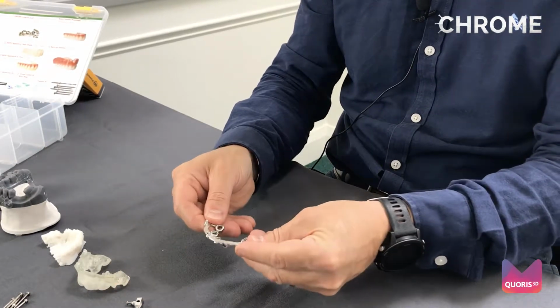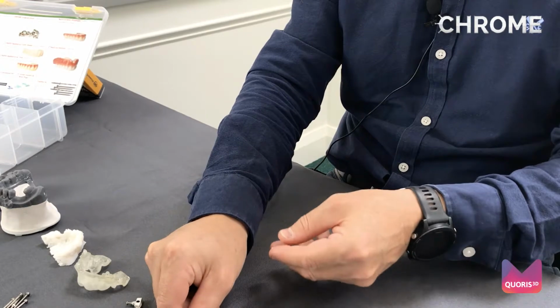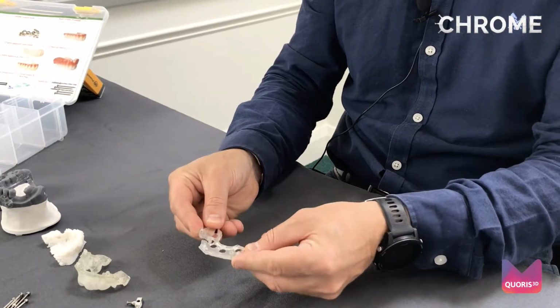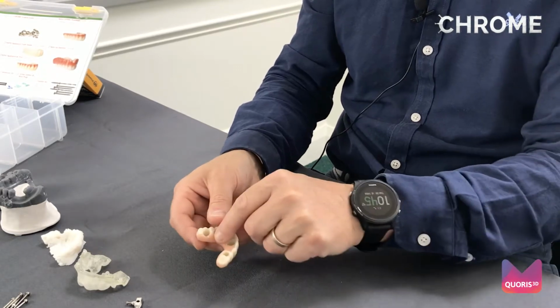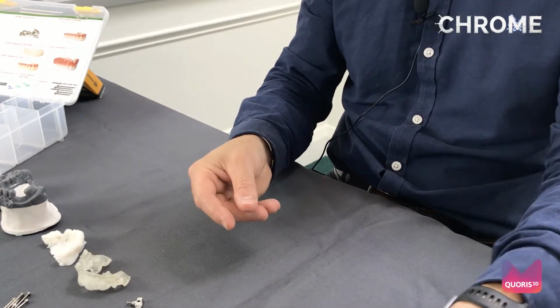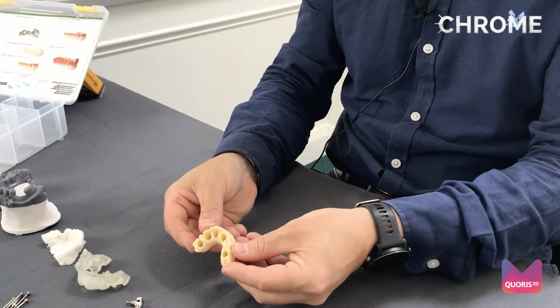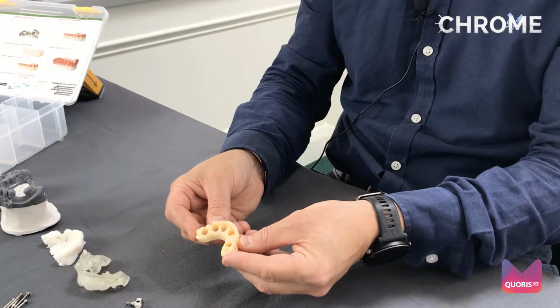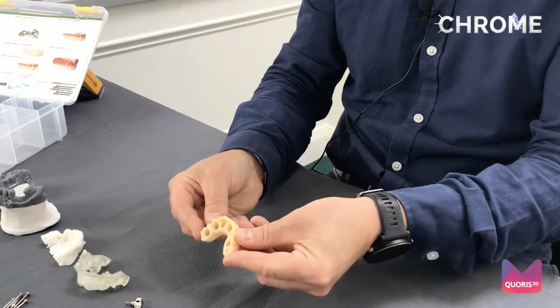You've got your osteotomy guide. You've got your transfer plate for your prosthetic. You've got your temporary prosthesis. And you've got your rapid appliance for efficient prosthetic transfer. And this is 3D printed.